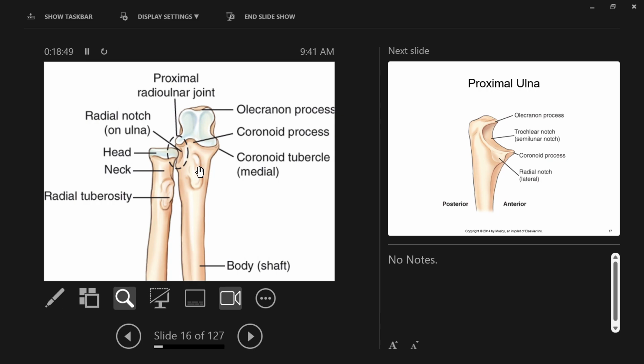We'll also need to learn several different ways of positioning during radiographs to view that bone, right? One of the best ways is to do a full extension AP view like this, okay? Right, palm up, arm fully extended. But I don't know if anyone's had this experience with patients. Often when people have actual injuries to the elbow, including radial head fractures, they're stuck like this. They just won't or can't go into full extension, okay? So we're going to have to have several ways of positioning the elbow so that we can get these views.